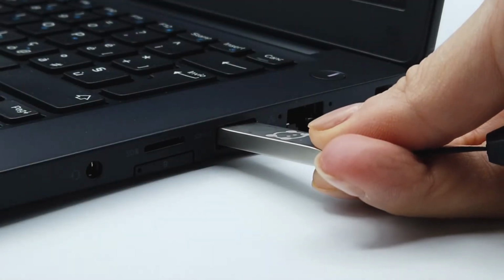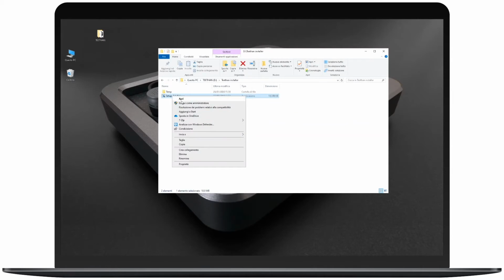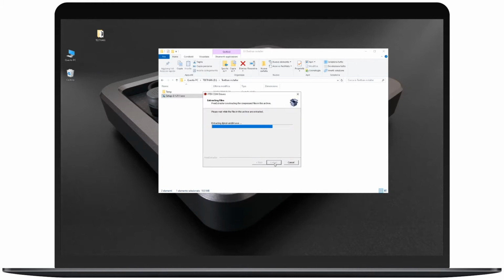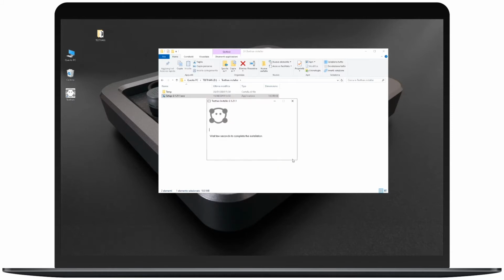Plug in a USB flash drive to your PC, select My Computer and open the installer folder. Launch the software setup. Follow the wizard. Click on Accept. Click on Install. Extract and follow the instruction by clicking Next, End, Next, Install, Finish, and you will see the installation completed successfully. Click Close and wait a few seconds to complete the installation.